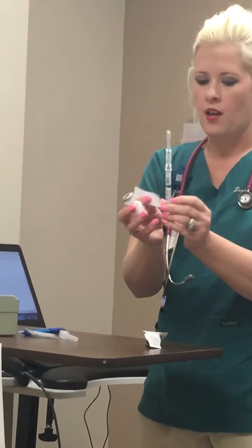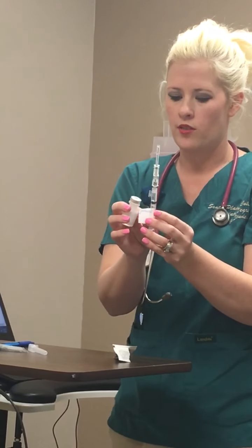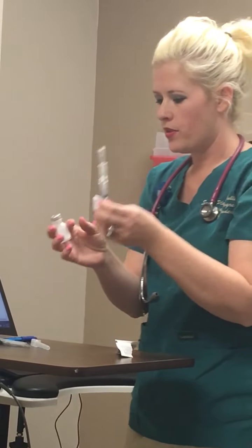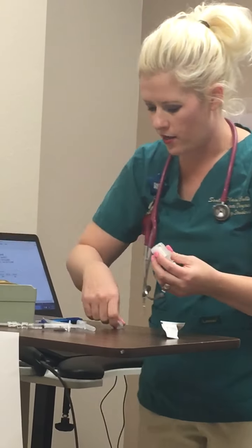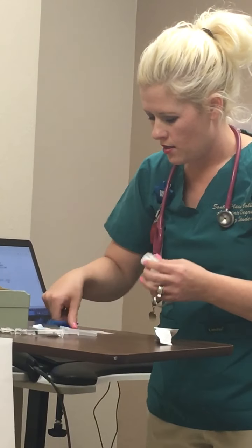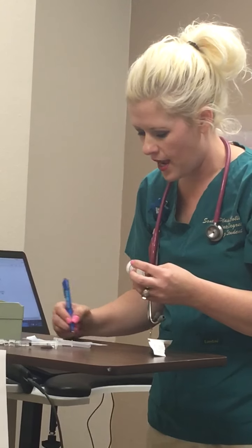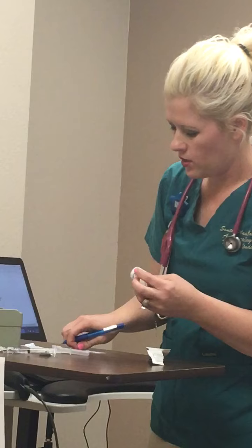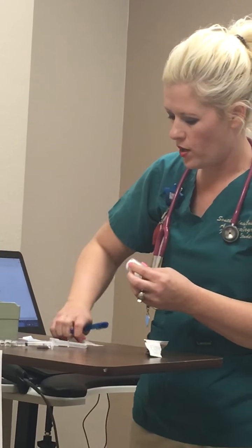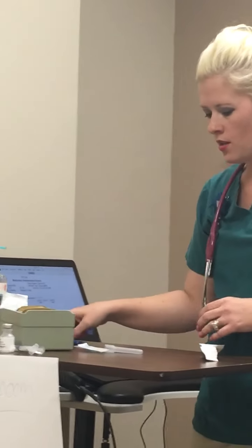I'm going to label this syringe so I know exactly what it is, making sure that when I'm labeling, I'm not labeling where I cannot see the medication. I'm going to flag it. I can now put this down because I know exactly what it is, and I'm going to label the bottom of my vial. I'm going to put my initials, the date, the time, so that the next person knows when this was last used. So my vial is now labeled. So I've prepared this medication.